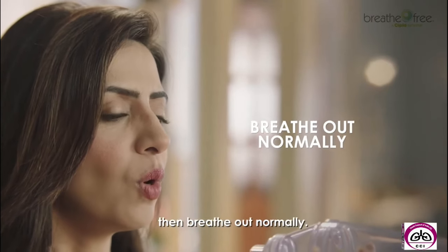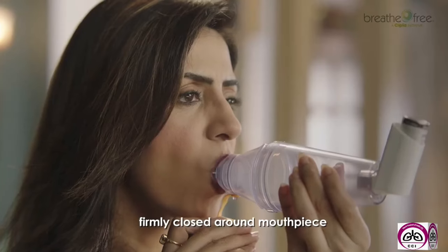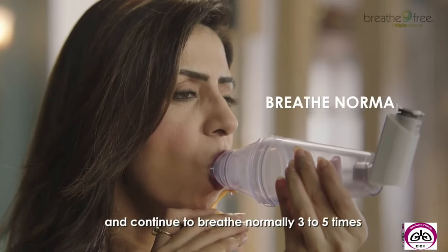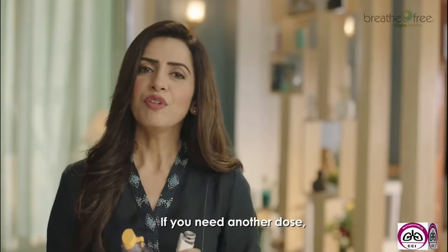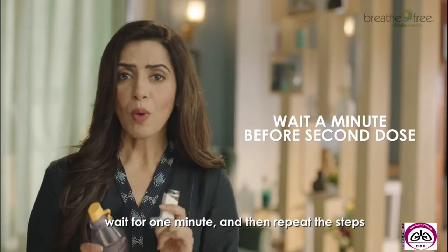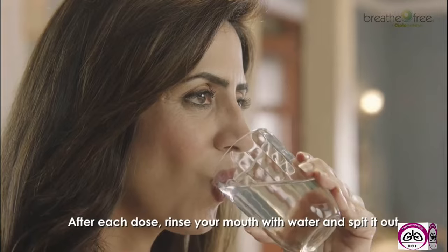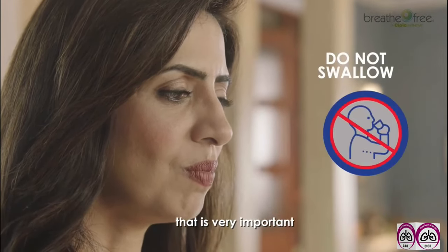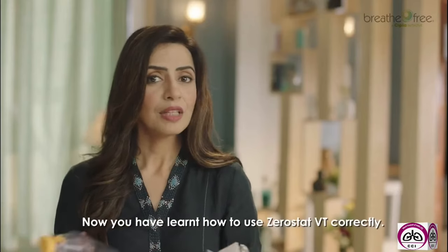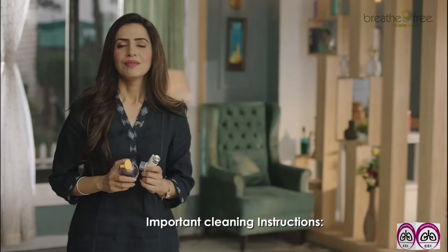Then breathe out normally or alternatively, keep your lips firmly closed around the mouthpiece and continue to breathe normally 3 to 5 times. If you need another dose, wait for 1 minute and then repeat the earlier steps. After each dose, rinse your mouth with water and spit it out. That is very important. That's it. Now you have learned how to use Zerostat VT correctly.